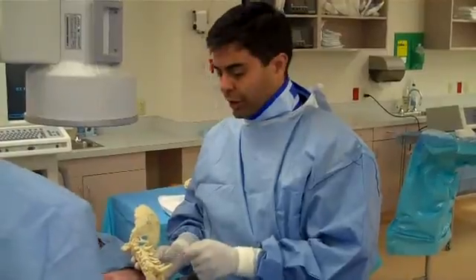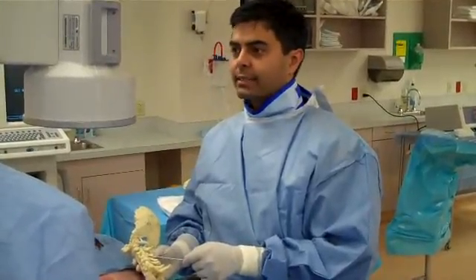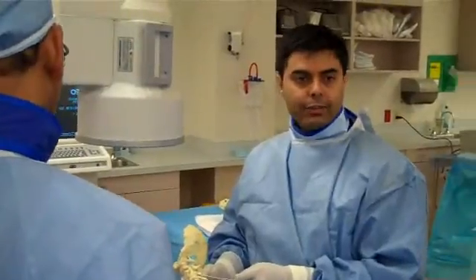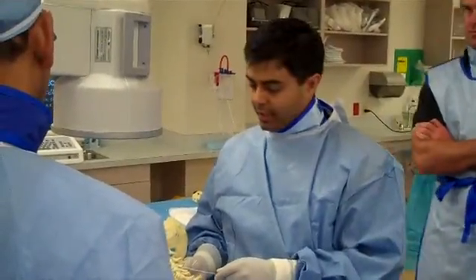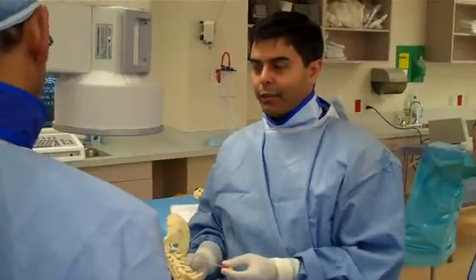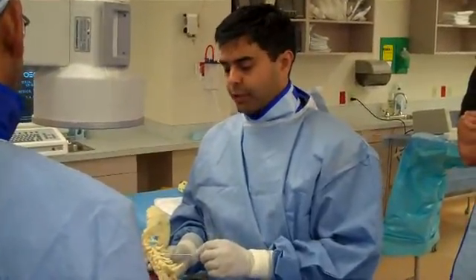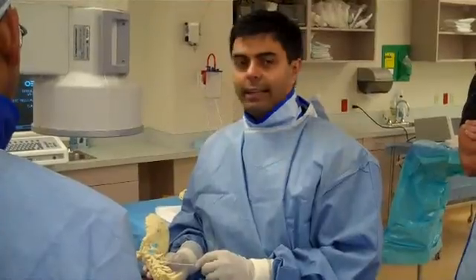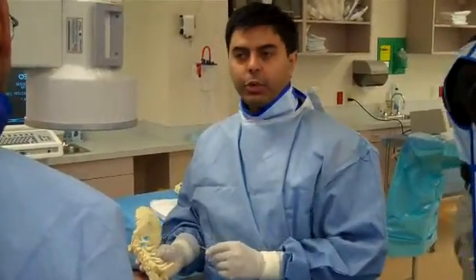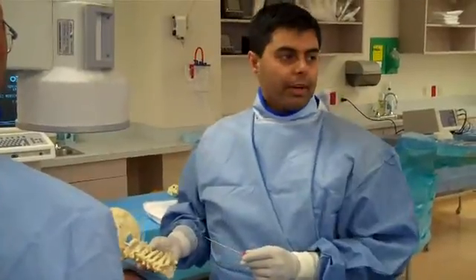Generally, I'll do 60 degrees for 60 seconds in the cervical area. Then you're going to turn your needle — 60 degrees, 60 seconds. Then go with your third lesion also, 60 degrees for 60 seconds. That's going to give you the widest field on the actual cervical spine.